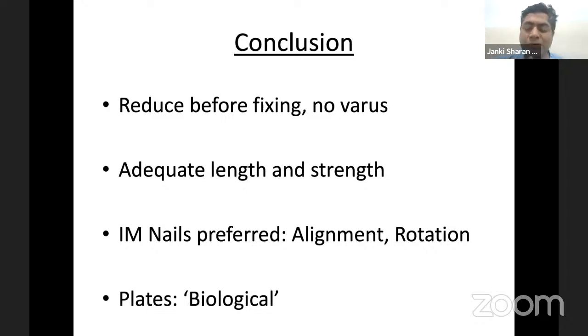One more thing, sir. Even if we are doing open reduction, do you go with the lag screw, cerclage wire, or plate as provisional fixation and then do the nailing, or just hold with some instrument and then proceed? If my bone holding clamp doesn't hold the fracture stably, or the cerclage wire proves inadequate, there's a very good trick.